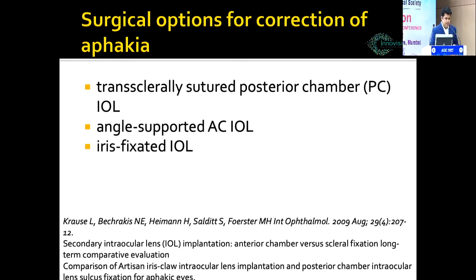Angle supported ACIOL is something we've all done during our residency days, and we've all started with those kind of ACIOLs.